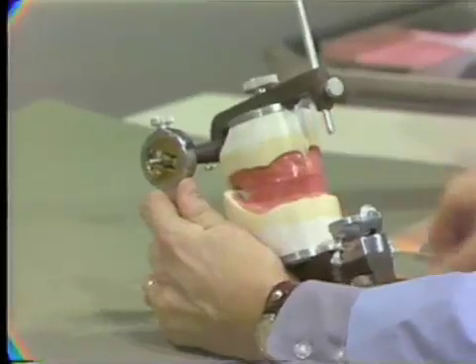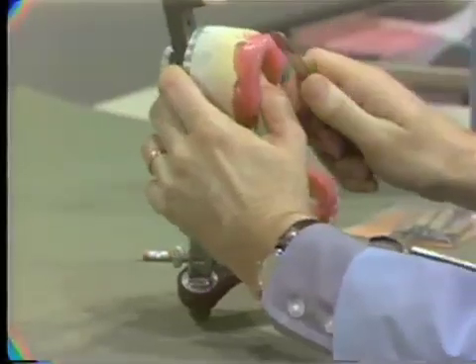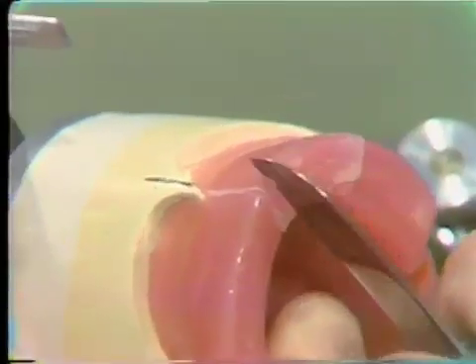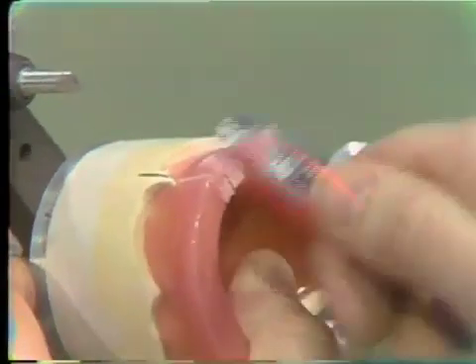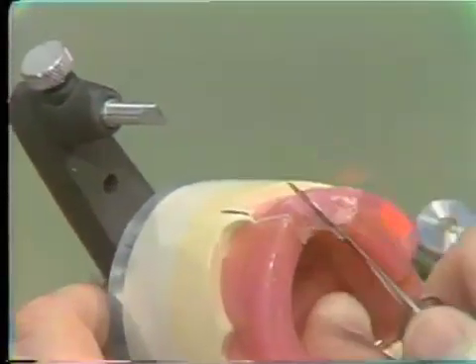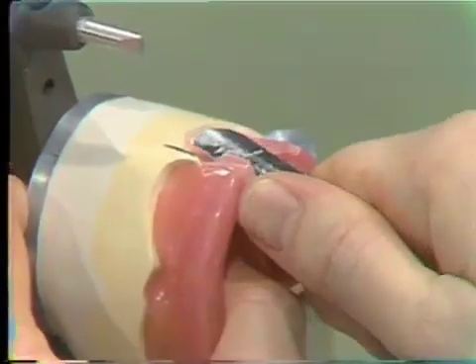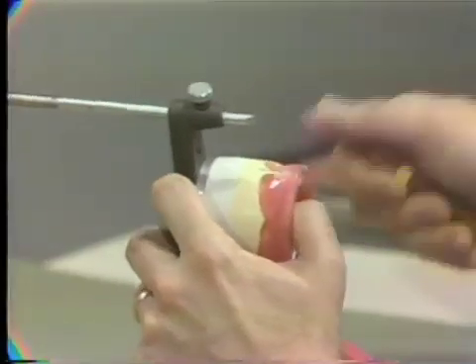Now, as the first actual step in setting the teeth, we remove a section so we have room to set the teeth, and we remove a section from the midline to the bicuspid area on one side. Now, when we set teeth, it's advisable not to set the teeth into a mass of wax. We're using the bite rims as a guide for setting teeth, but not necessarily to set the teeth in the rim. Now, sometimes this is done, but it makes it very difficult to wax the denture at a later stage. So I would advise this procedure where we actually remove the wax rim in a certain area and then set the teeth directly on the base plate using some excess wax.